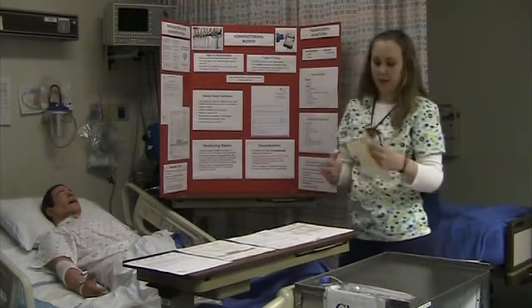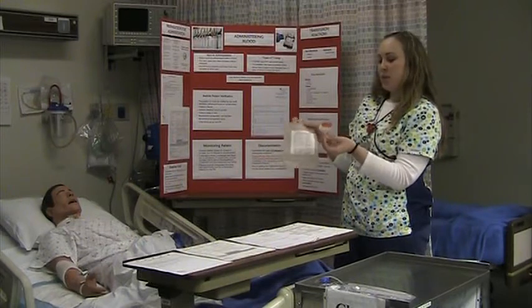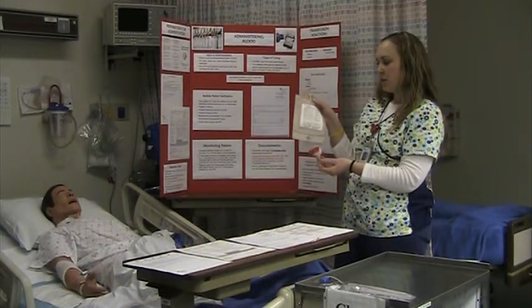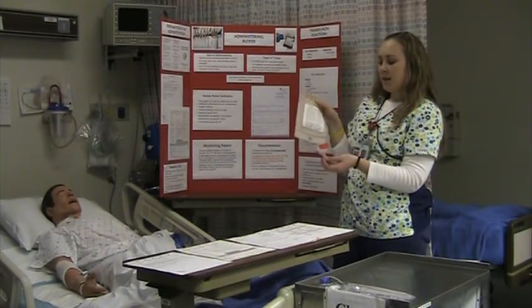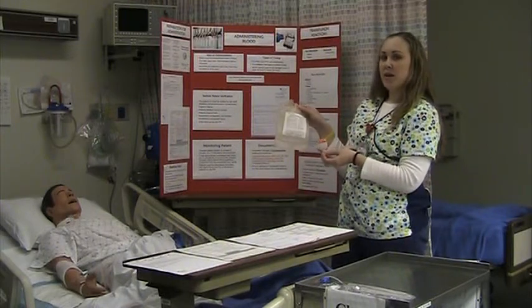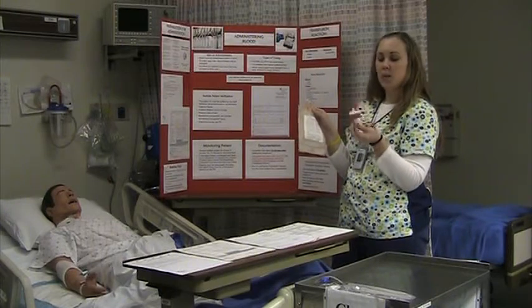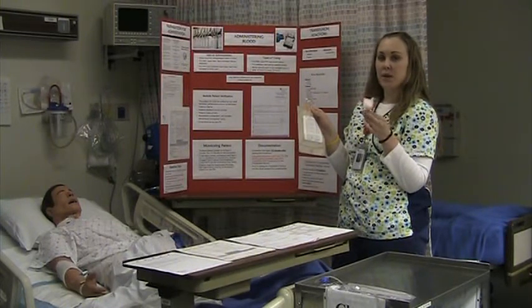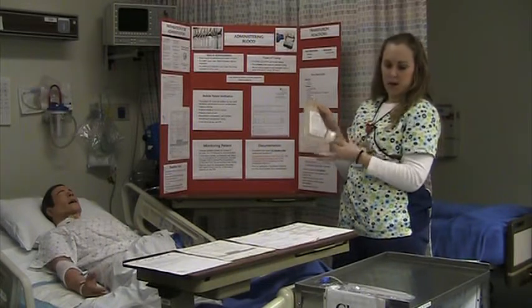This here is another blood set. The tubing is not here, but the important thing here is the filter and the bag. It comes with surgical patients that we have here at Valley Care. This is for orthopedic patients when we're processing the patient's own blood and then giving it back to them. So the important thing to know is that we always want to have this filter, and then we just use the regular IV tubing. Doesn't go on a pump. It goes as fast as the patient can tolerate, okay?